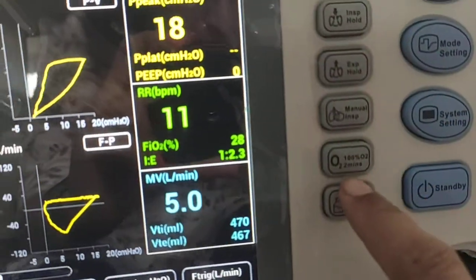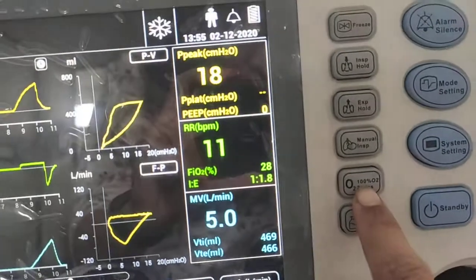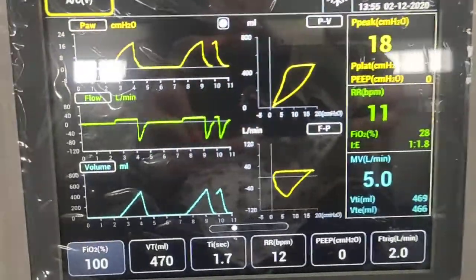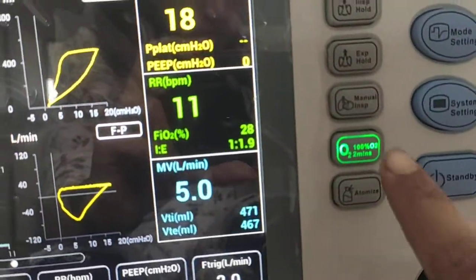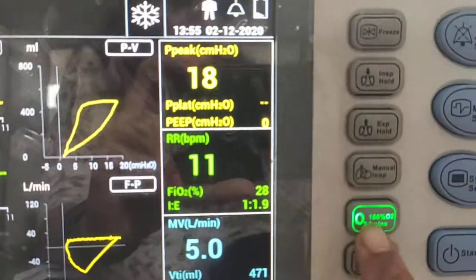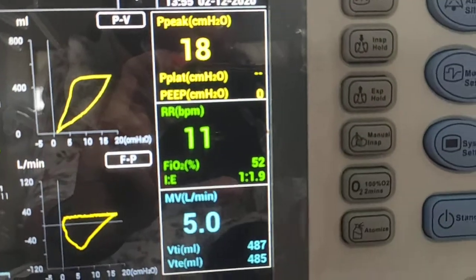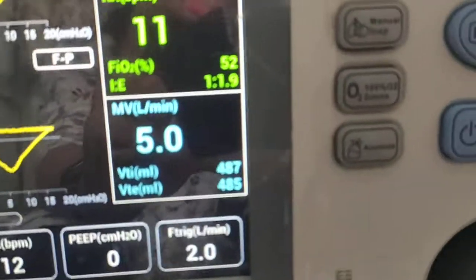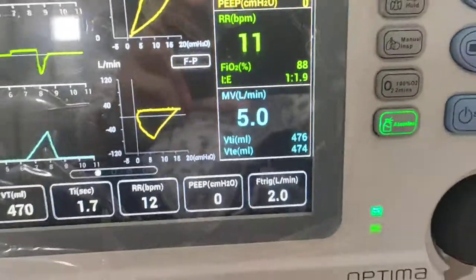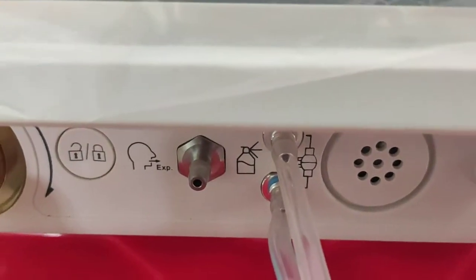The 100% oxygen button delivers 100% O2 to the patient for two minutes, and the monitored O2 value will be visible on screen. After that, the atomizer option is for nebulization, and this is the nebulization port on the ventilator.